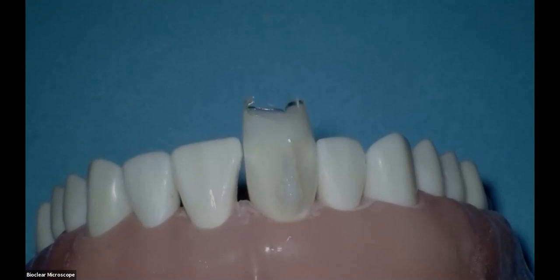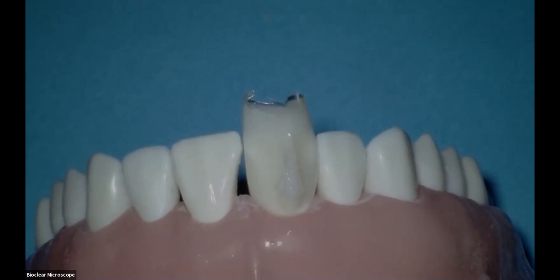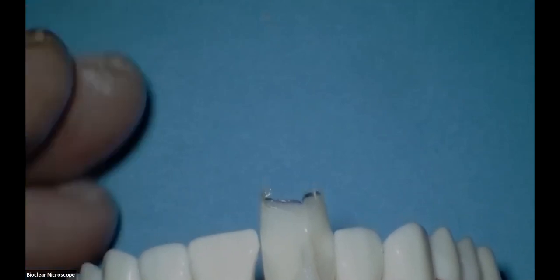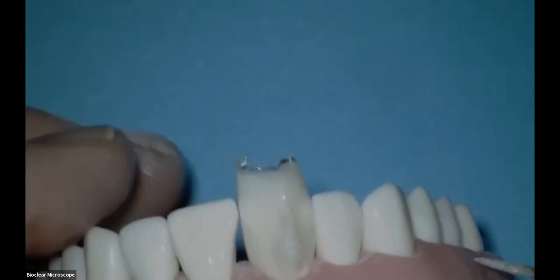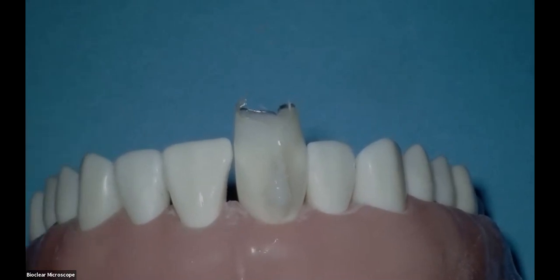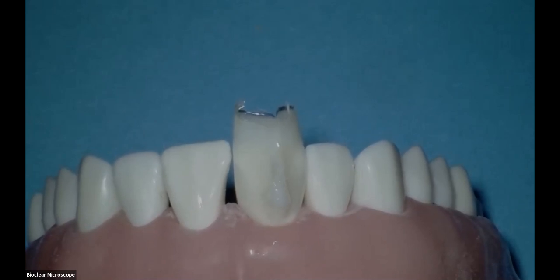I would add to his question, do you use laser every time when you do a diastema closure? I don't own a laser. Lasers are great, but I don't use them for this. The second question about isolation is, we give a little bit of local anesthetic that will provide some hemostasis, and the matrix provides a little bit of lateral pressure against the gums. And so we're able to, because the matrix is only there for a few seconds before we injection mold, with the rubber dam, it is literally bone dry.